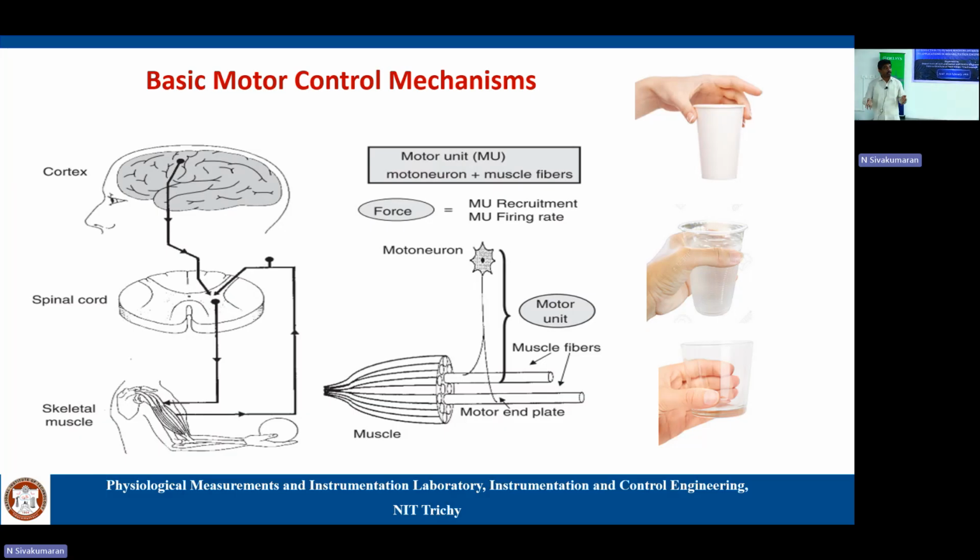Particularly for tetraplegics, whose hands and legs are not working, signals recorded from facial muscles can be used. But where do we place the electrodes? These signals are noisy. Whatever signal you use should be reproducible, and only then can I use it for control purposes. If it is not reproducible, what is the use of it? So again, another issue is standards.